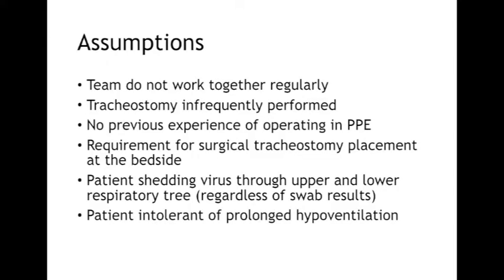In ideal circumstances, these procedures will be performed by teams familiar with working both with each other and with the procedure. However, we do identify that given possible patient numbers and unfamiliar working environments, we have tried to produce a document that will allow teams who do not typically work together, may not perform tracheostomy frequently, who have not had previous experience of PPE, to perform this as safely as possible.